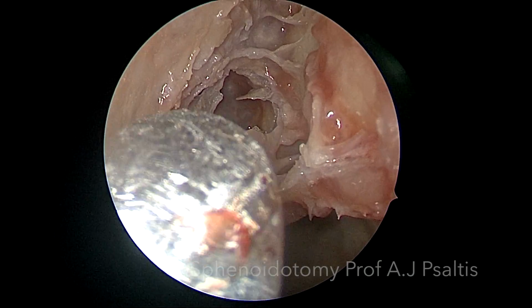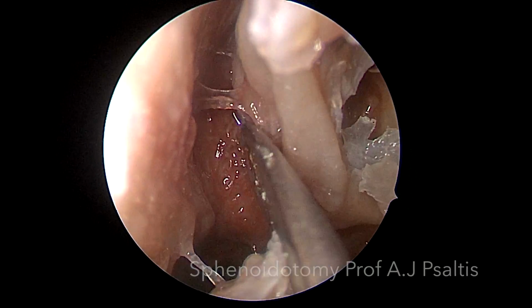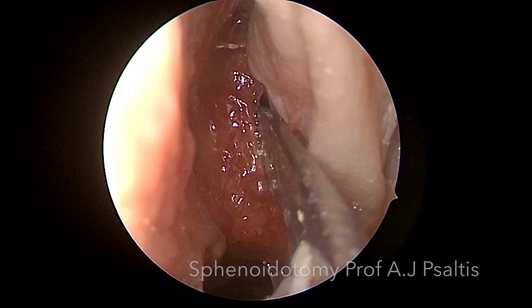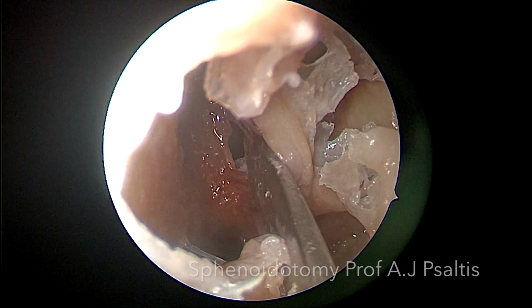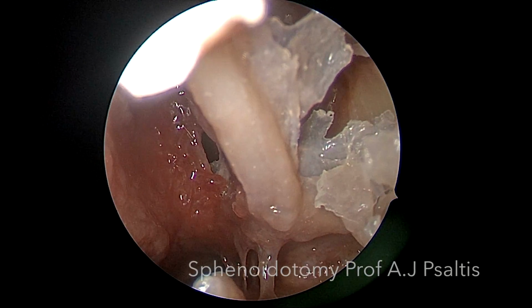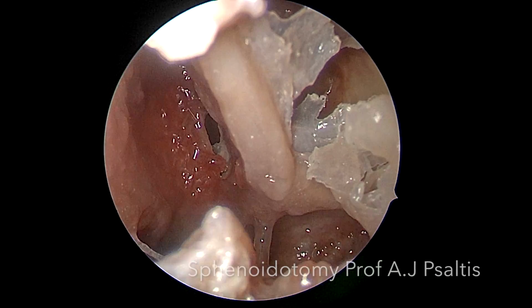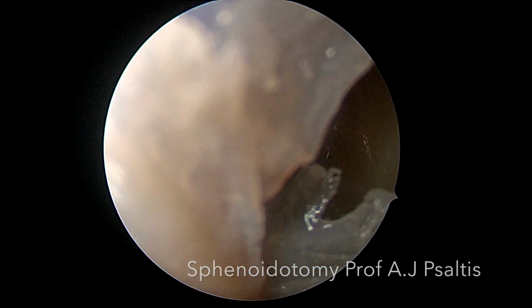The superior turbinate is the most important landmark when performing a sphenoidotomy, as the natural os is always located medial to the superior turbinate. Here we can see the natural os, which is typically in humans covered by a thin membrane. Using a freer, we can sharply enter the sphenoid sinus and then widen it with the freer forceps. This allows maximal preservation of the superior turbinate and in turn respect for olfaction.